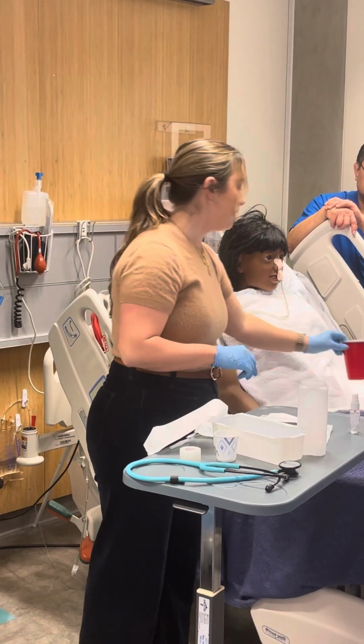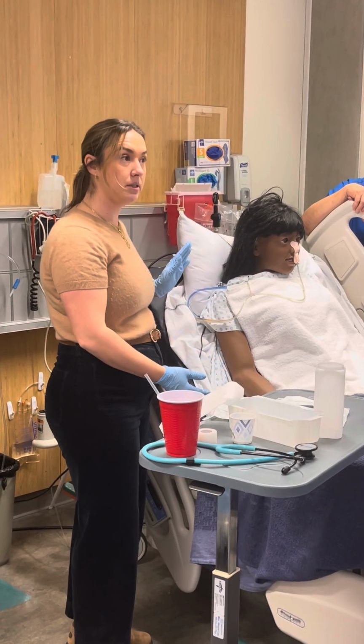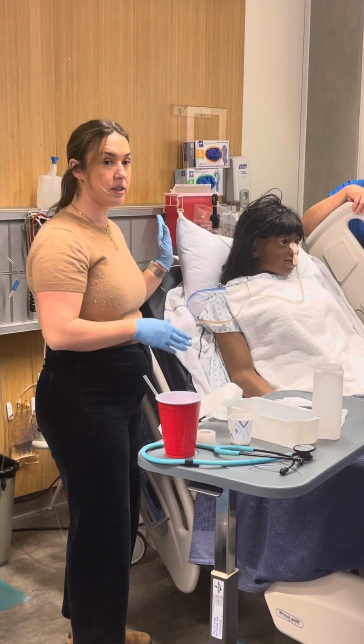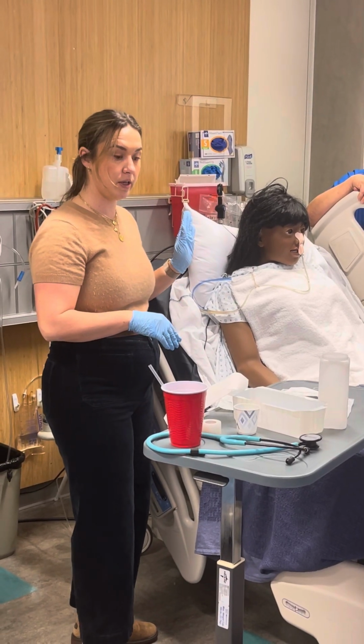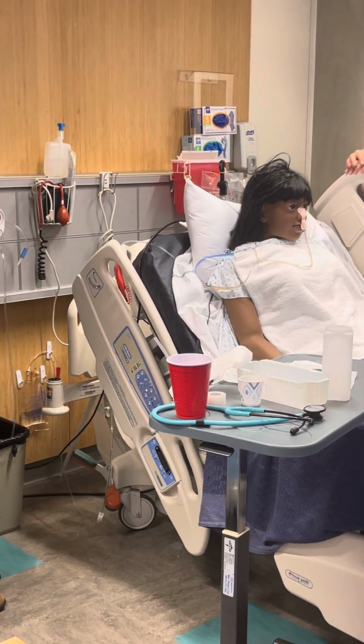Then you're gonna get your chest x-ray to confirm your placement. I'm gonna show you how to connect it to suction, but you don't have to do this for your videos. We're gonna come over here to your suction device, your wall suction.